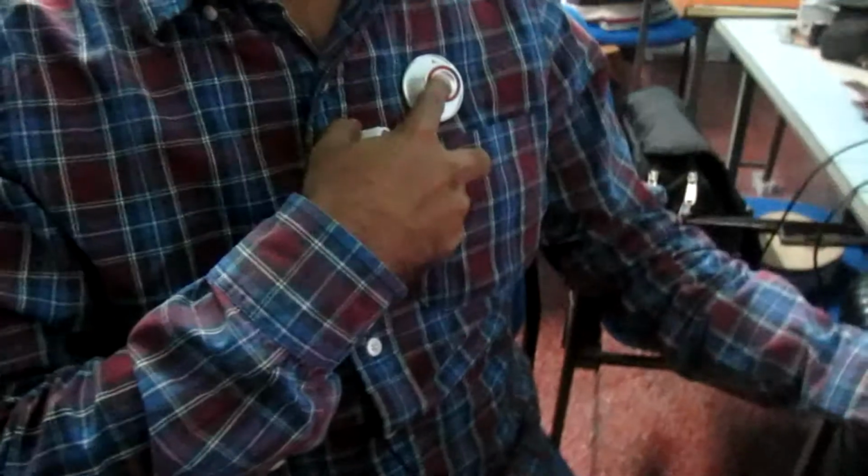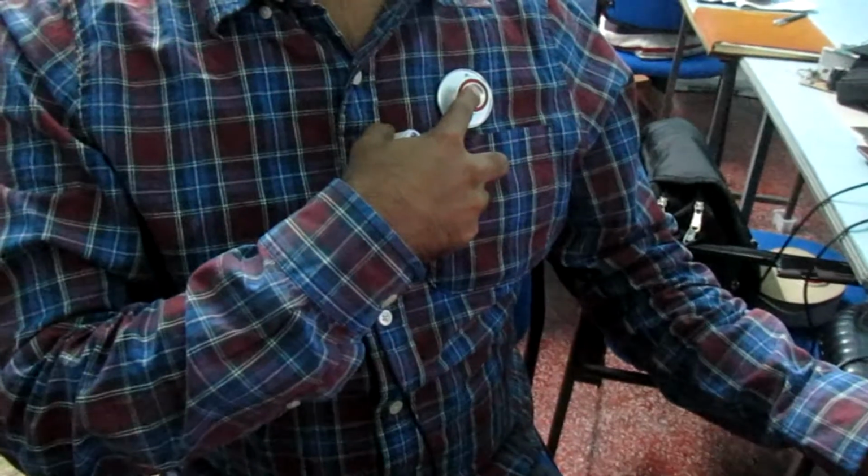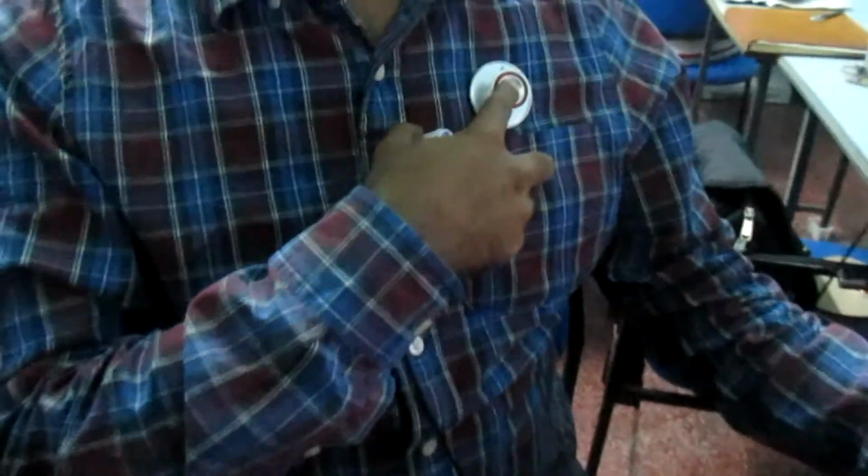and then we press it on our chest and press record here and record the sounds, preferably for 10-20 seconds. Okay, let's do it. Okay, we're done.